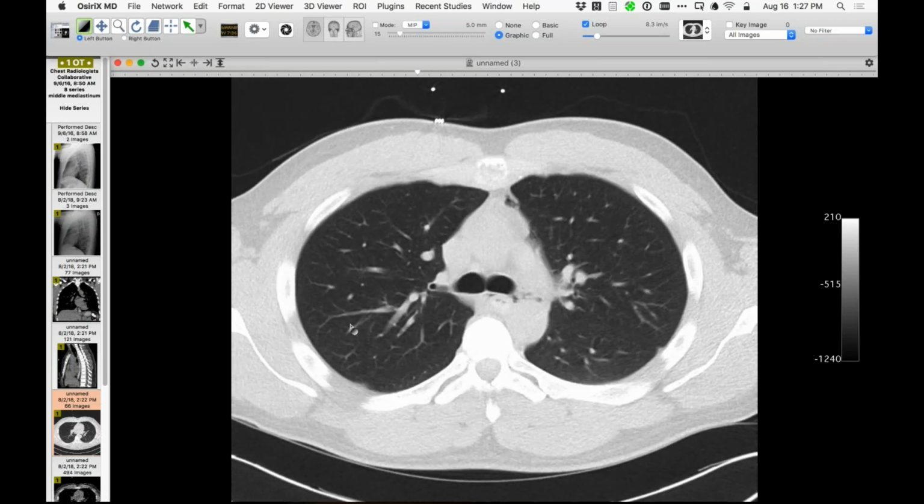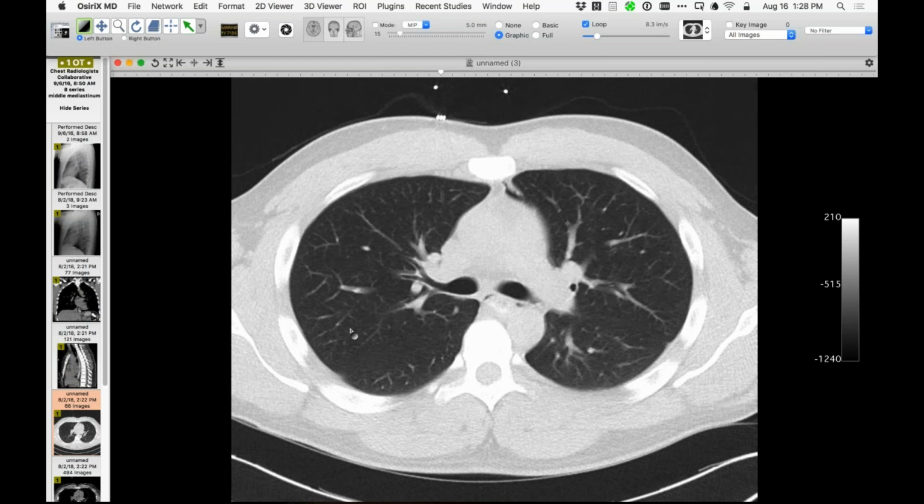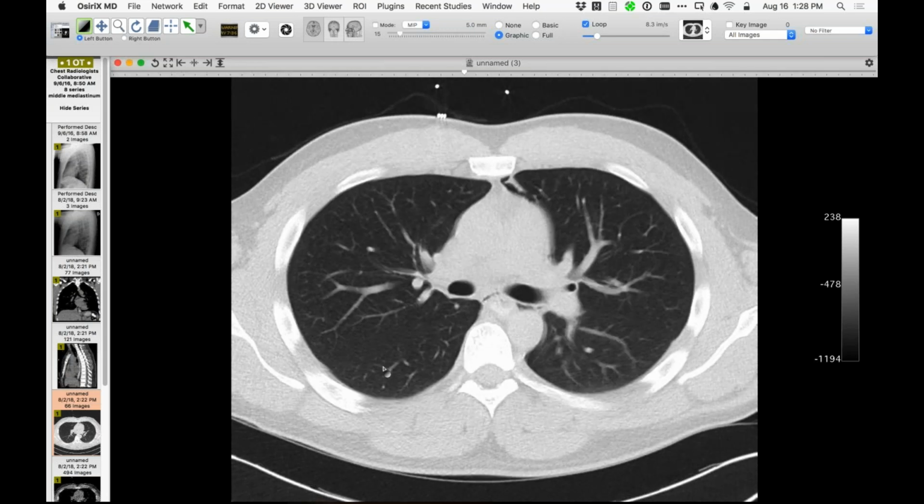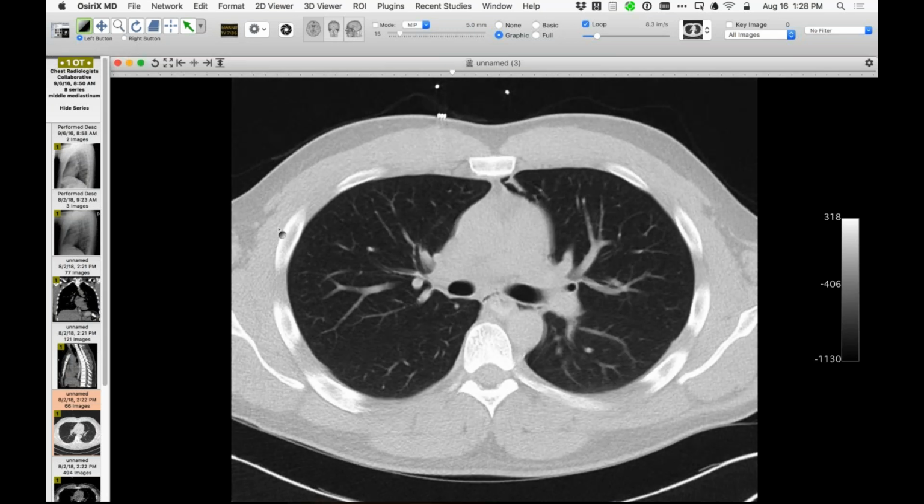But they insisted on doing a CT with contrast medium because they said that he afterwards started vomiting, and they were really concerned about his esophagus. So we did what they asked. He doesn't have any injury to the esophagus. So football player, Macklin phenomenon, and I'm sure he'll do fine. And he did fine.